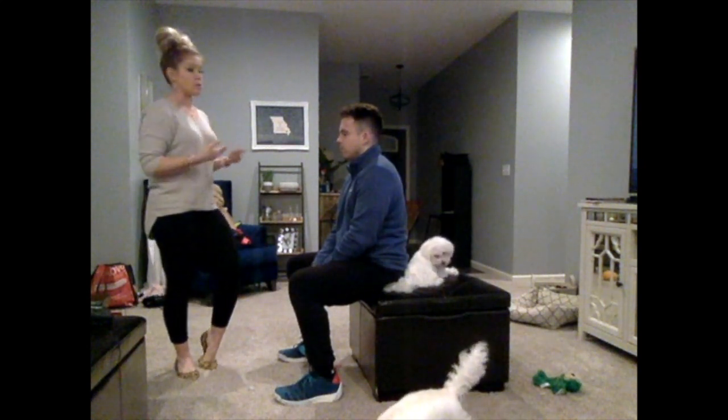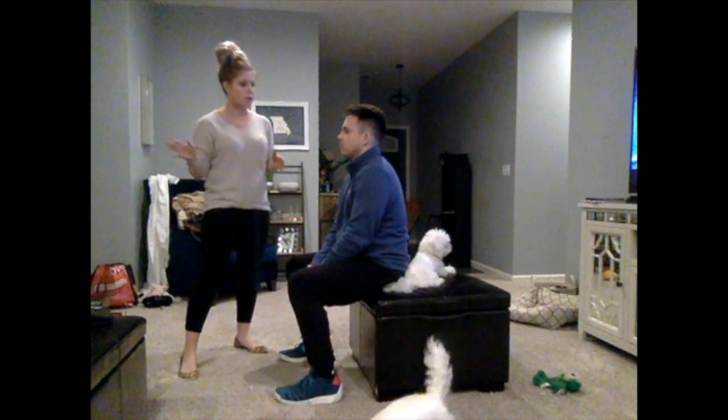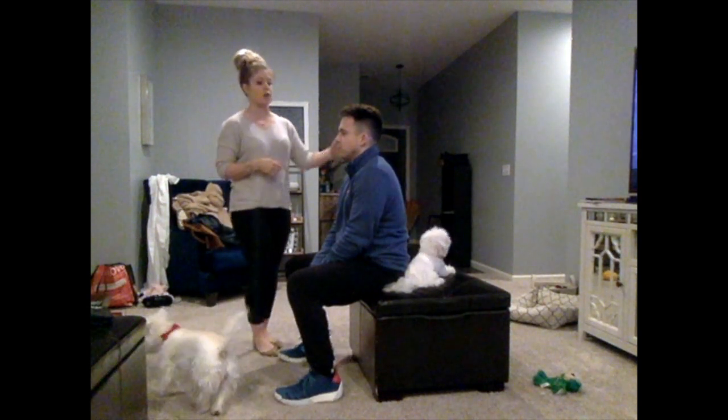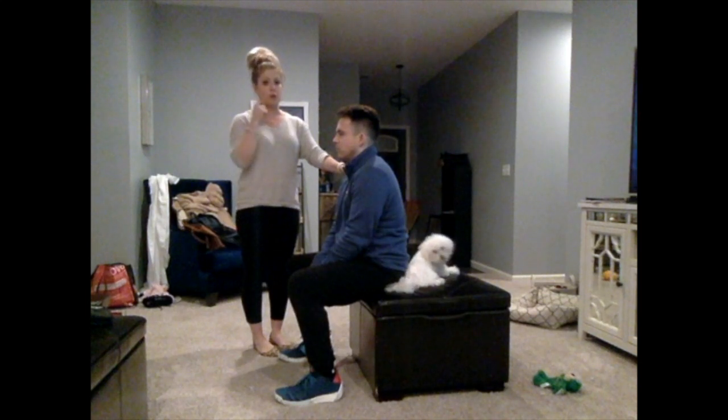Now I would do the fundoscopic exam, but since I don't have an ophthalmoscope, I'm just going to explain what I would do if I had one. So I'd have the patient look forward. I would move to this side, at about a 15-degree angle. I would place my left hand on the patient's right shoulder, and I'd take the ophthalmoscope and put it on my right eye if I'm checking his right eye.